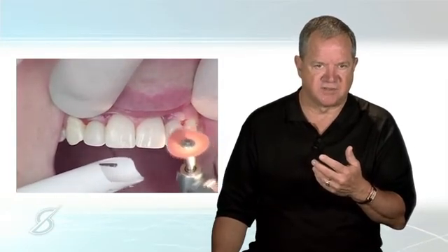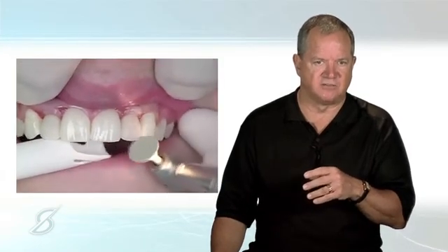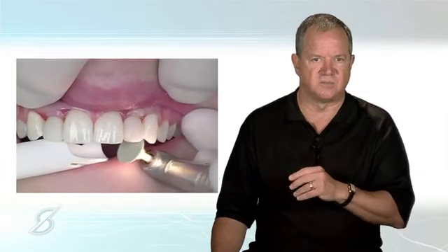And then go through your routine disking, finishing, polishing. These happen to be, a lot of it just with 3M discs. And the final polishing, the same thing, however you happen to work with your composite system. And now we've got both of them. The screw access holes are filled, and we're just doing our final polish with the finest of the discs. And then you can also use some of the nice rubber polishing aids that are available today. There's a lot of decent ones on the market. And there's our two single tooth implant temporaries the day they're seated.